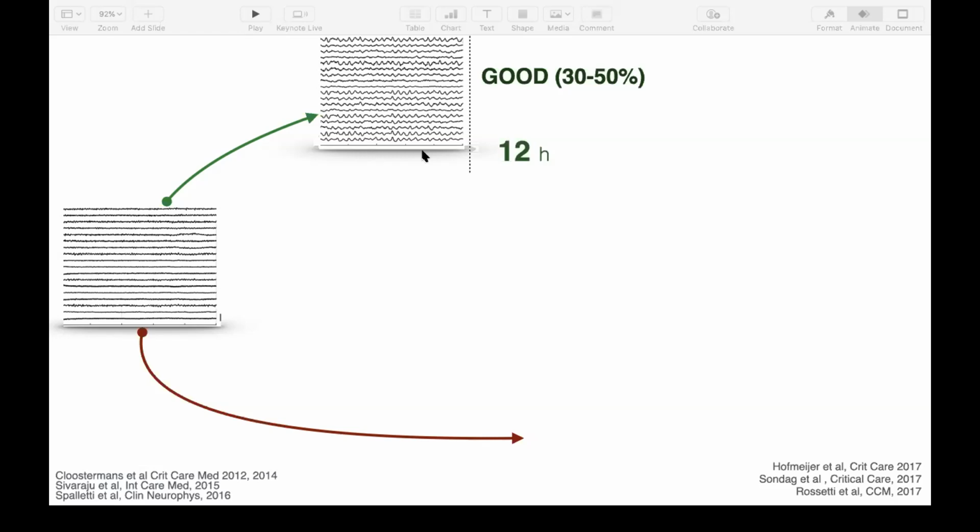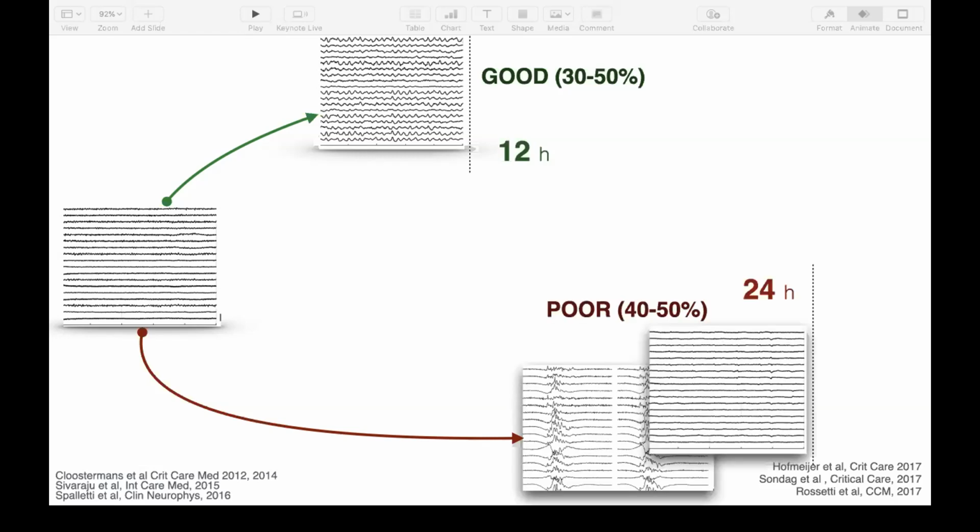On the other hand of the spectrum, we have patients that have a persistent flat EEG recording, and if this is observed at 24 hours after arrest, that is too long a time scale to hope for sufficient synaptic recovery. Then there's much more irreversibly damaged than only synapses. So this is indeed associated with significant neuronal death eventually as well.